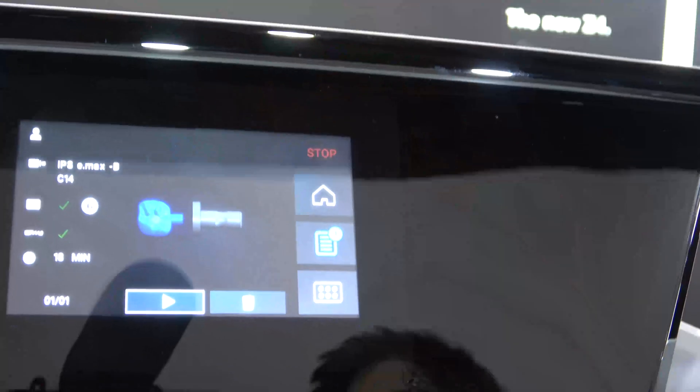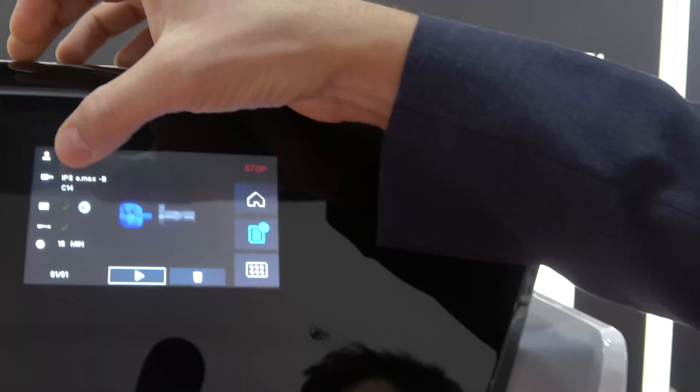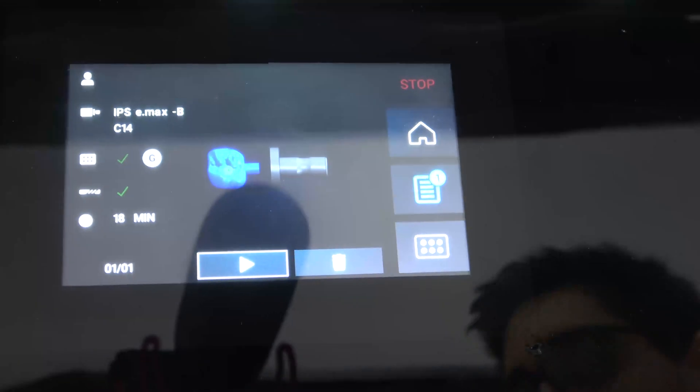What we want to do is — we see here on the touch display our job overview. On this touch display we find which kind of material we want to use. Right now you can read here we want to mill an e-max block.